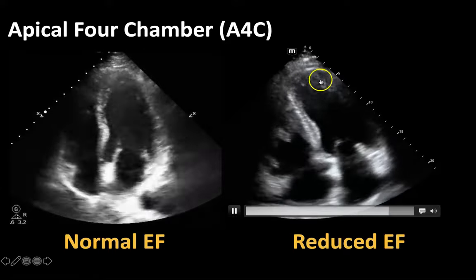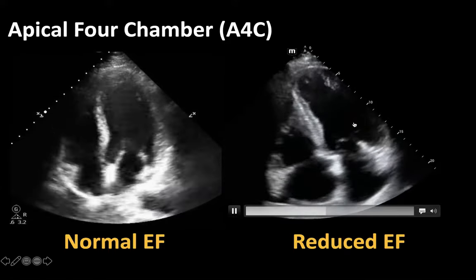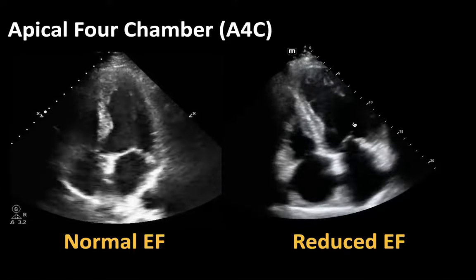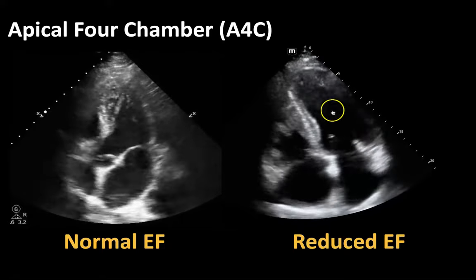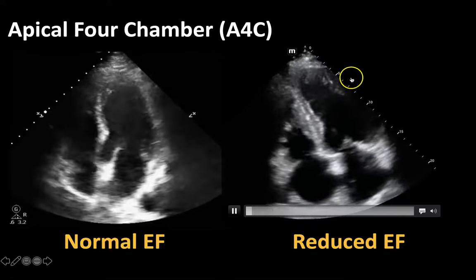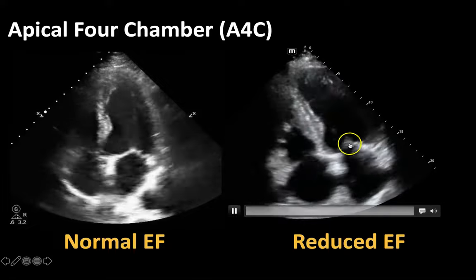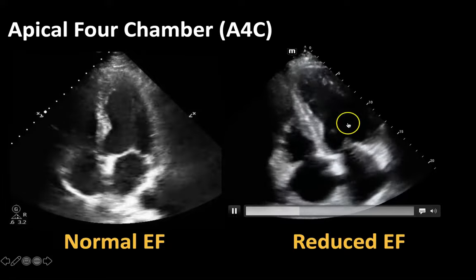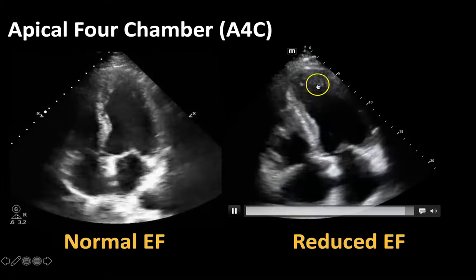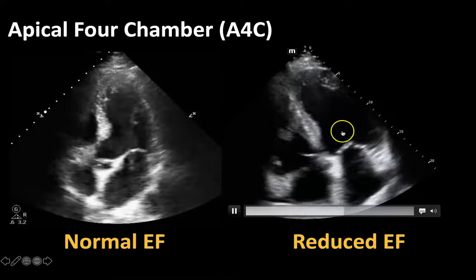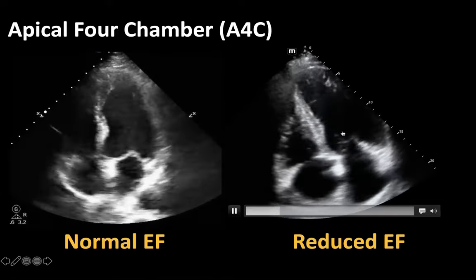As opposed to this heart now on the right side of the screen — same apical four chamber view — this is your left ventricle right here. You're going to imagine that line right in the middle, and you can see that the walls really are not coming close to the center of the ventricle. This is a heart with a reduced ejection fraction.